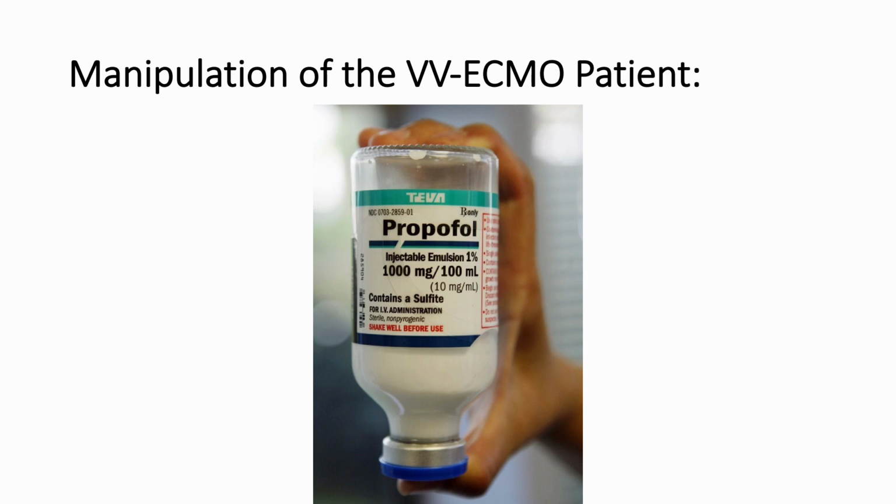Given their physiologic instability and need to tolerate the continued placement of large intravascular cannulas supporting their oxygen needs on a second-to-second basis, sedation certainly seems reasonable for these profoundly unwell patients.